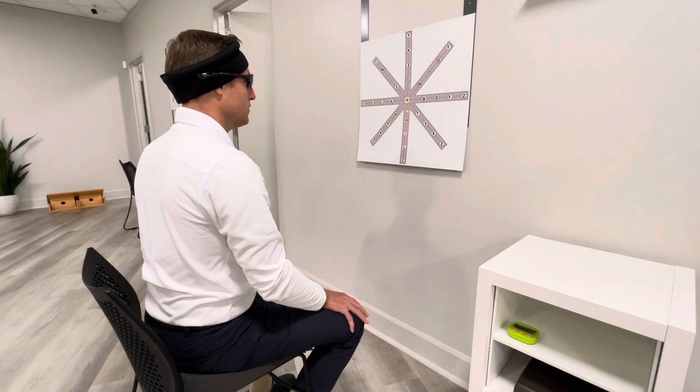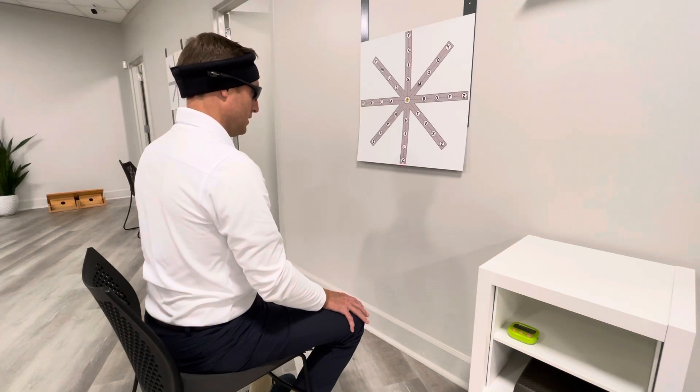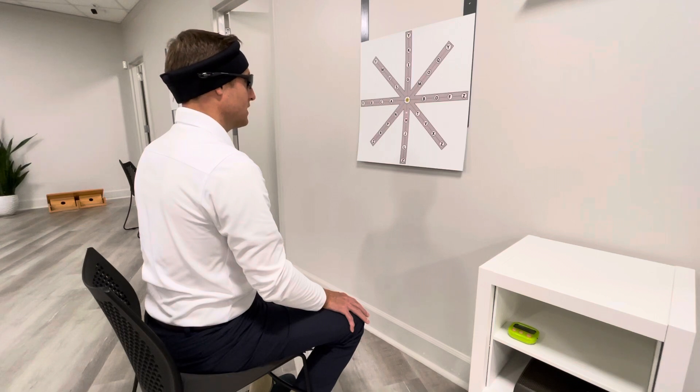So I'm going to do one more set again so you can see. Look up at G. My eyes are now up at I. My eyes are up at K. And my eyes are up at Y. Now I'm closing my eyes and reopening on the laser, and slowly trying to be accurate and stay on that vertical line and go back to center.